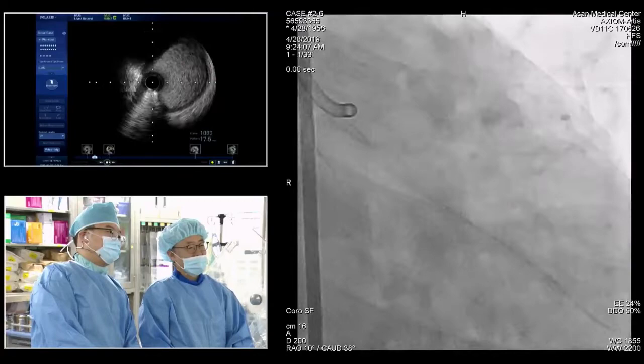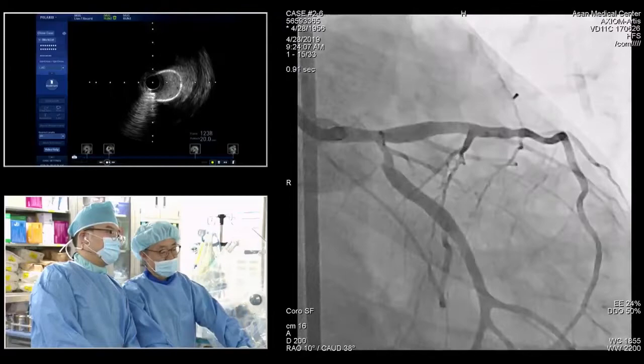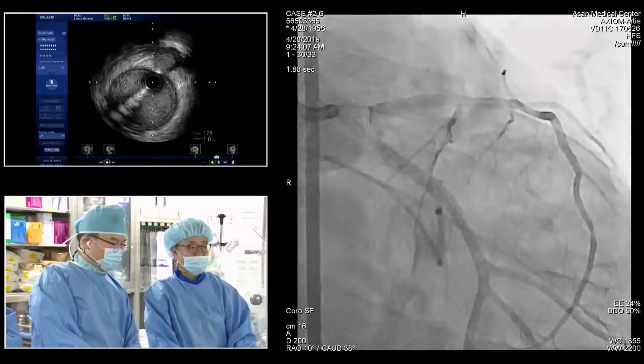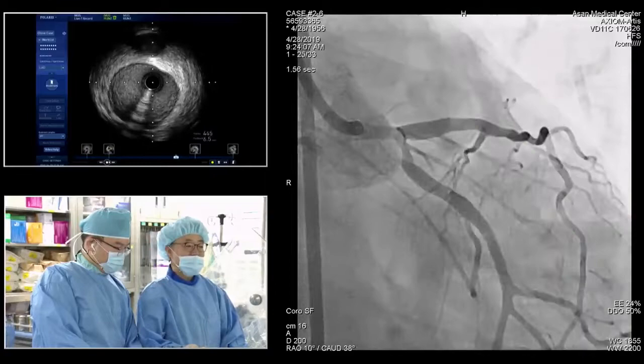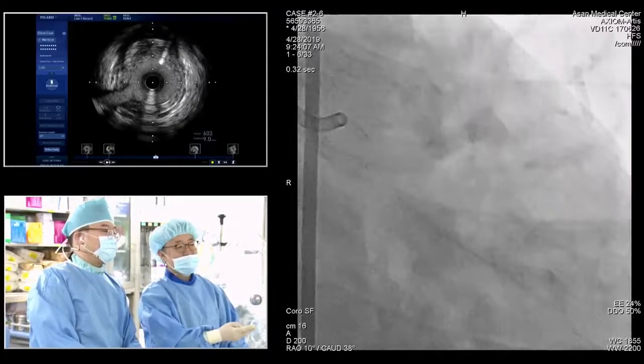Well, I think most second generation DES can be taken up to more than 5 millimeters with the appropriate balloon sizing. So no real preference, given the size of the bifurcation opening we can make. And for these cases, I expect a lot of debate about which strategy was better, single provisional stenting or a two-stent strategy. This is the most difficult to decide.